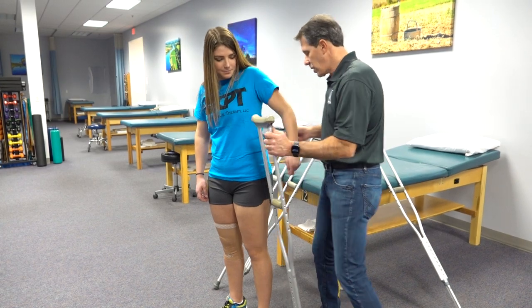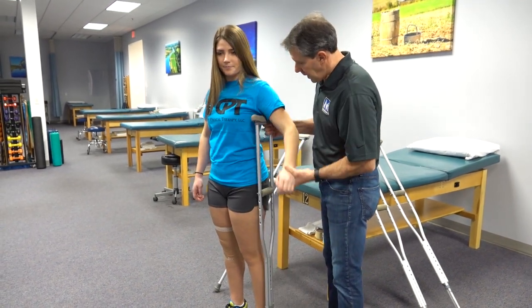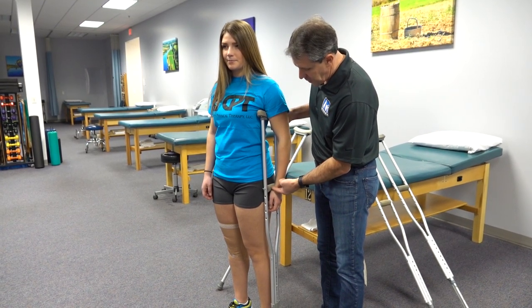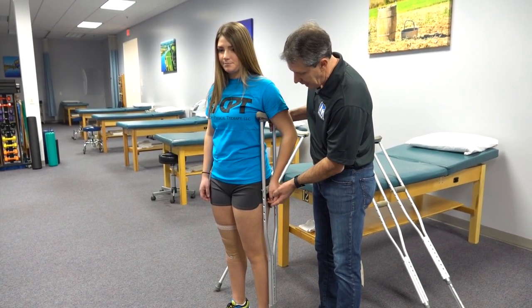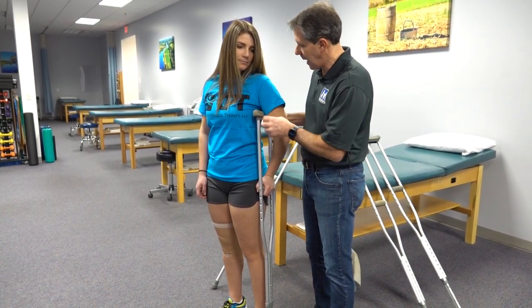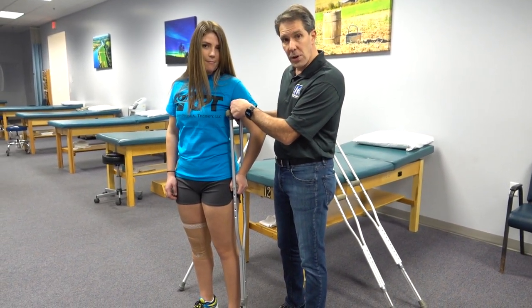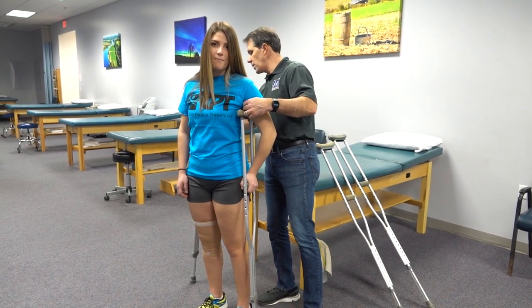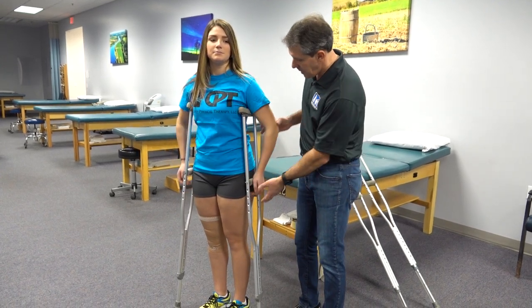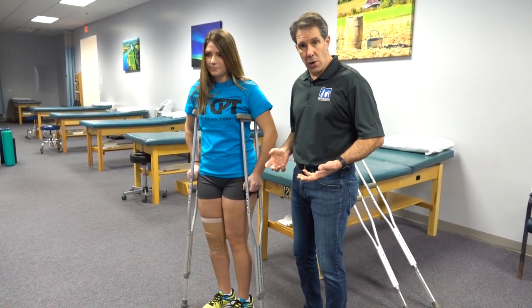Now we're going to talk about the appropriate fitting crutches. We let the arm down by the side and notice that the wrist is at the handle, which is where it needs to be, so that when she puts her hand on the handle we have a slight bend in the elbow. This allows her to put pressure through that hand, and we have about two to three fingers maximum between the armpit and the top of the crutches. Taking the other crutch on the other side, we notice the same slight bend in the elbow, and when she's ready to use the crutches she can put the pressure through the hands to get herself going.